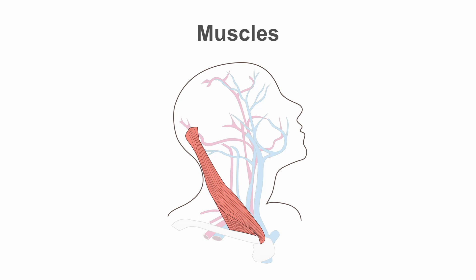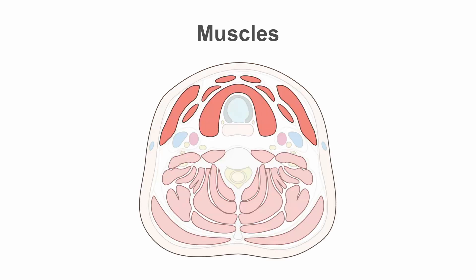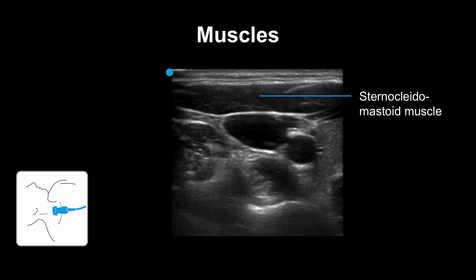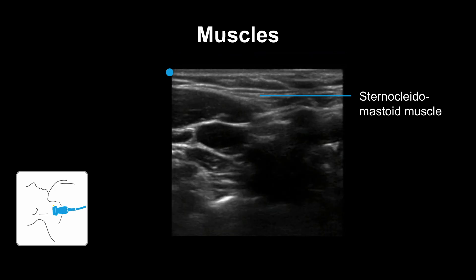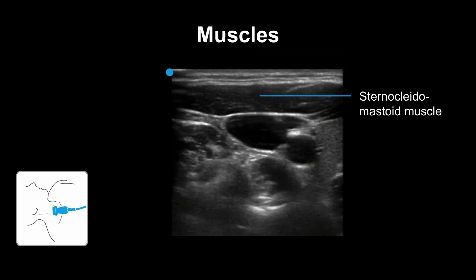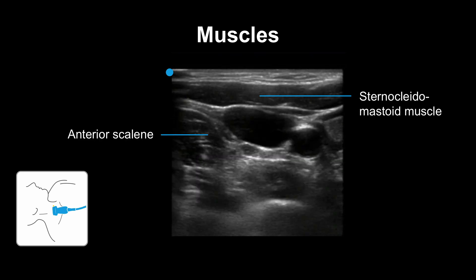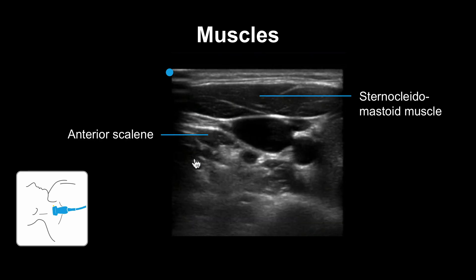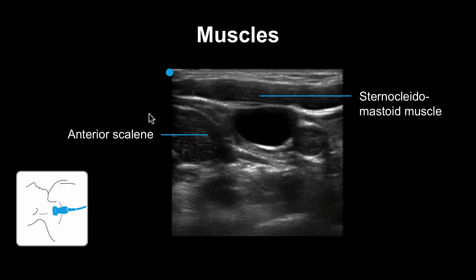Now we can talk about other structures you may encounter in the lateral neck. One of these is muscles. The striated structure you see here is the sternocleidomastoid muscle; the operator is bringing the probe from the clavicle up to the mandible. You can also see the anterior scalene in this view.